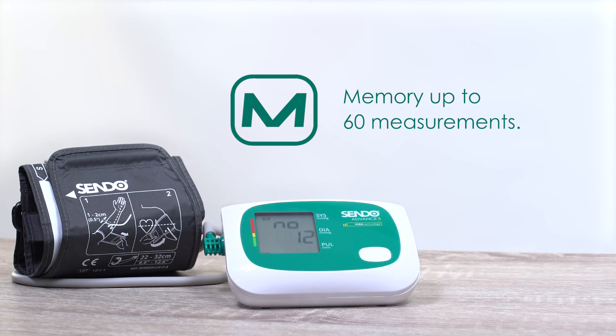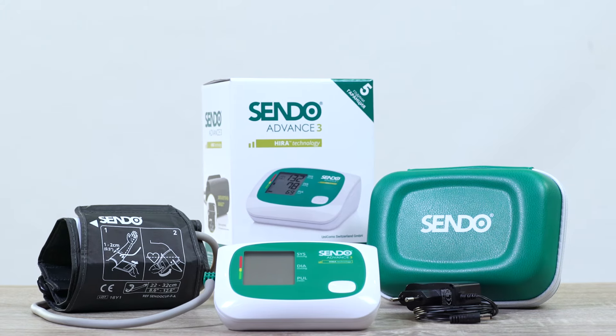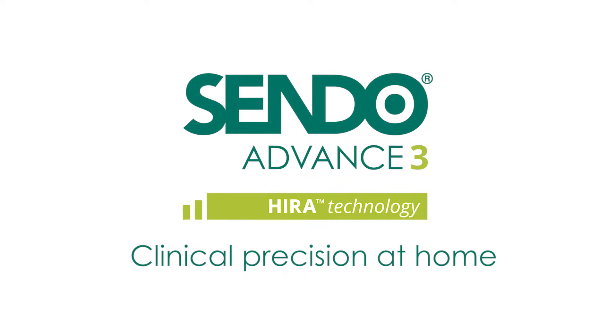Measurements are saved automatically in the device memory. Sendo Advance 3 is compact and resistant. Sendo — clinical precision at home.